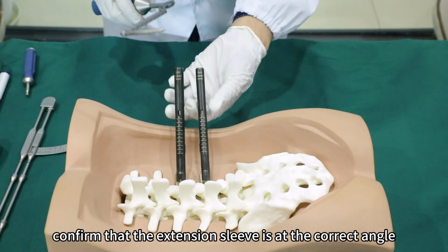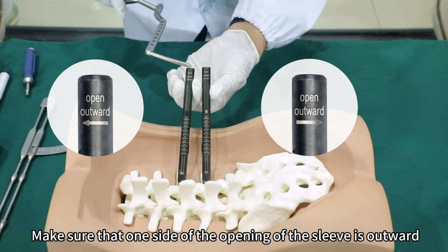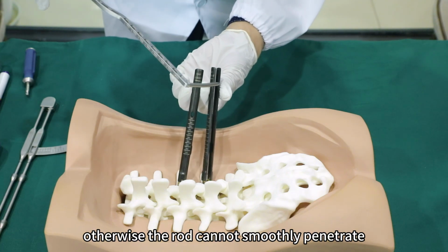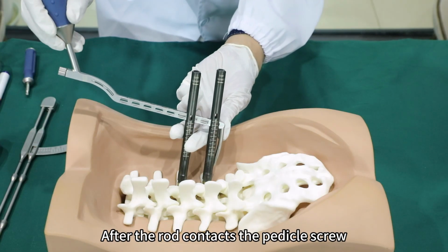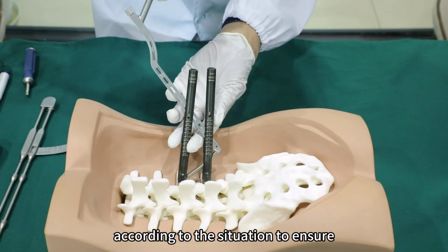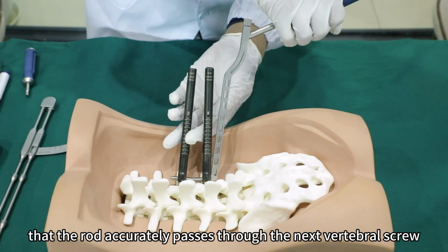Before threading, confirm that the extension sleeve is at the correct angle. Make sure that one side of the opening of the sleeve is outward. Otherwise, the rod cannot smoothly penetrate into the appropriate position. Insert the rod along the opening side of the sleeve. After the rod contacts the pedicle screw, thread the rod between the minimally invasive sleeves according to the situation to ensure that the rod accurately passes through the next vertebral screw.